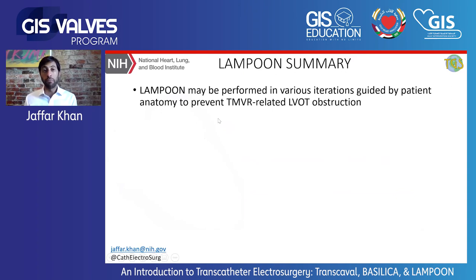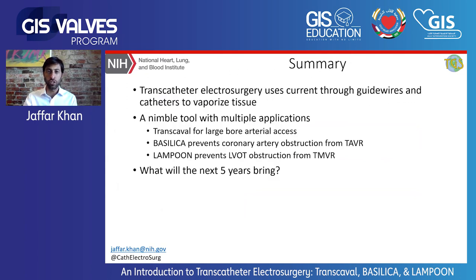So in summary for LAMPOON, LAMPOON can be performed in various iterations, the simplest iteration being tip to base LAMPOON, and it's guided by the anatomy. It can prevent TMVR-related LVOT obstruction.